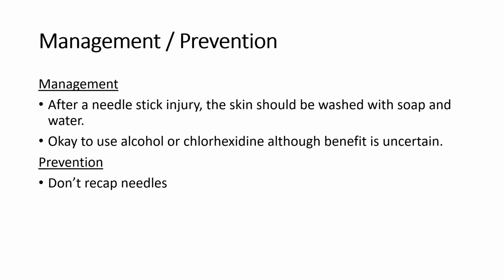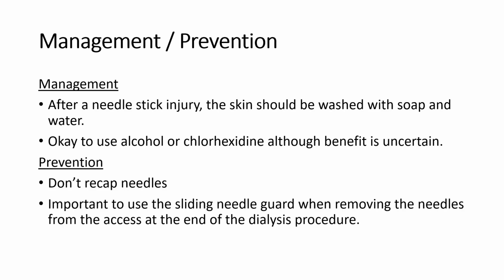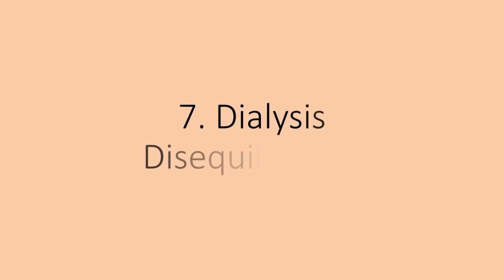Regarding prevention, of course, we don't recap the needles. We used to do that in medicine. That was a very bad idea. That's when most injuries occurred. It's important to use a sliding needle guard when removing needles from the access at the end of the dialysis procedure. The next preventable error that I'd like to discuss is something called dialysis disequilibrium.